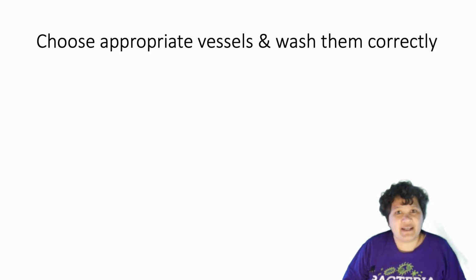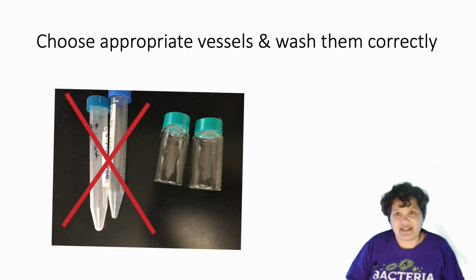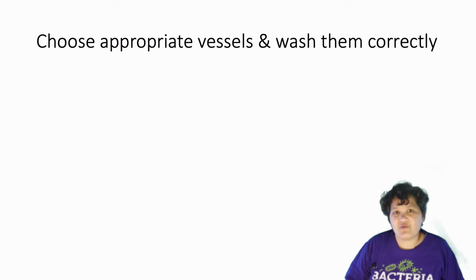When you're looking for organic chemicals, you don't want to use a lot of plastic stuff because plastics are made of organic chemicals. You're also going to want to ensure that all of your tools and containers are free from contamination. Not only contamination of your analyte, but anything else that could serve as an interference in your method.